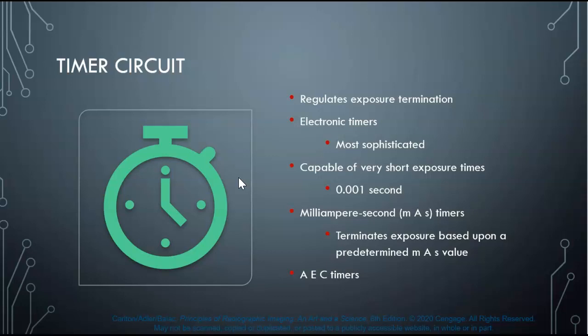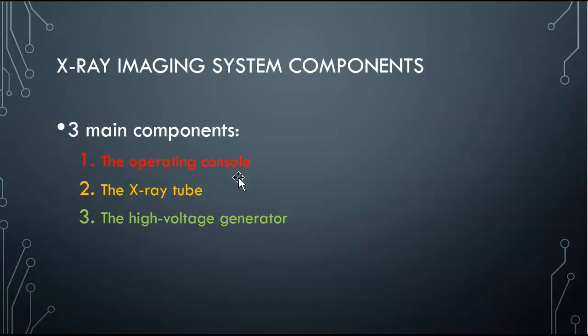All right, the timer circuit. It regulates the exposure termination. We use electronic timers as they're most sophisticated. It's capable of very short exposure times, which is great. Your mAs timer terminates exposure based on the predetermined mAs value, and there's an AEC timer also.